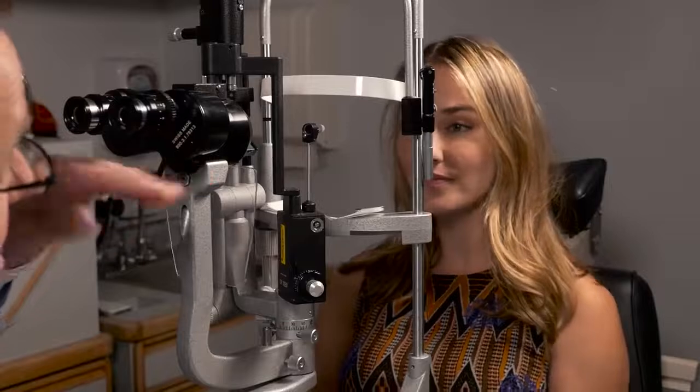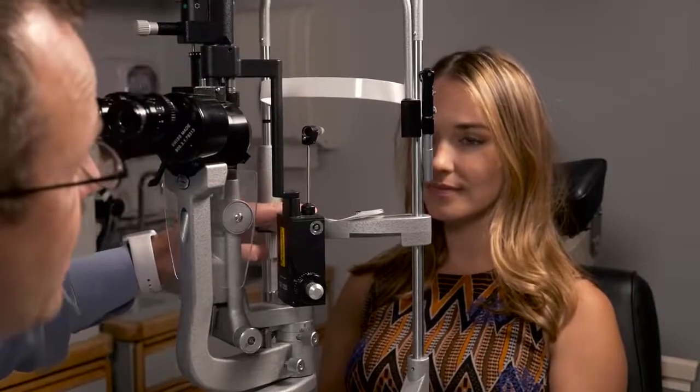My patient population is generally a little bit more elderly, and so you want to make sure that their back, their neck, and things aren't contorted. If they're comfortable in the slit lamp, you're going to be comfortable and be able to spend more time trying to find the diseases. So first thing you'll do is bring the slit lamp over towards the patient. You'll look where they are. The chin rest, I always eyeball where their chin is, and I'll bring it down to their level.